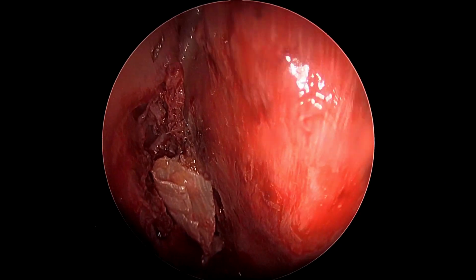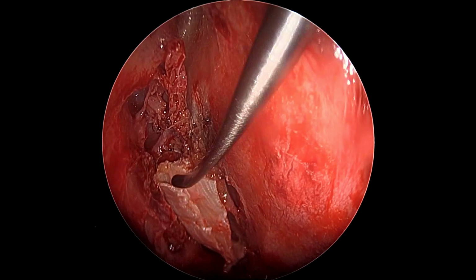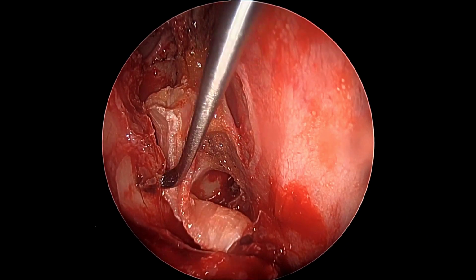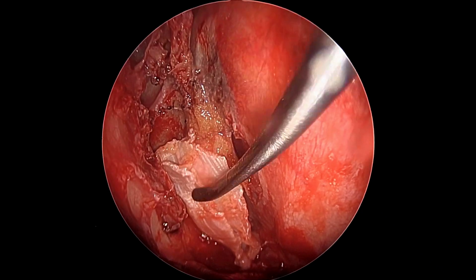Now, one must remember that fat cannot be left exposed to the air. It's going to dissolve, and that's not the point. So whenever we use fat for reconstruction, it has to be reinforced and covered with either fascia or a free mucosal graft in the middle, turbinate, or some kind of vascular flap. It cannot be left open.